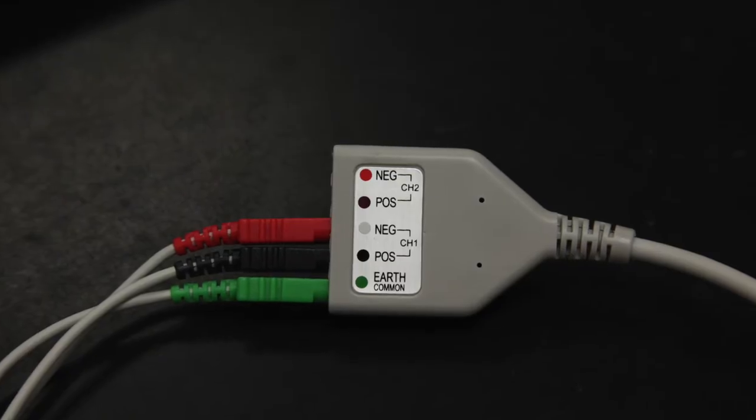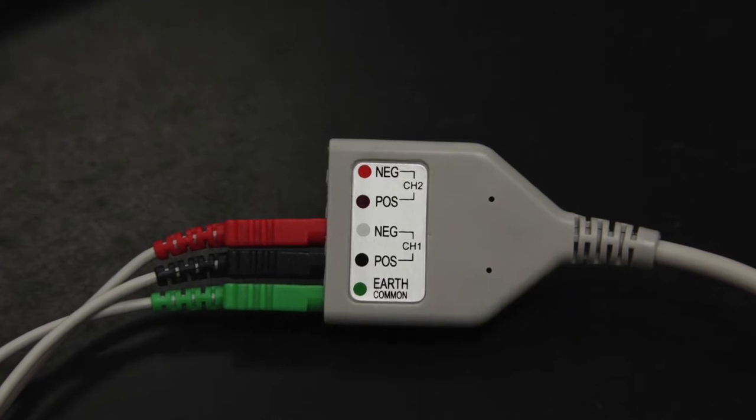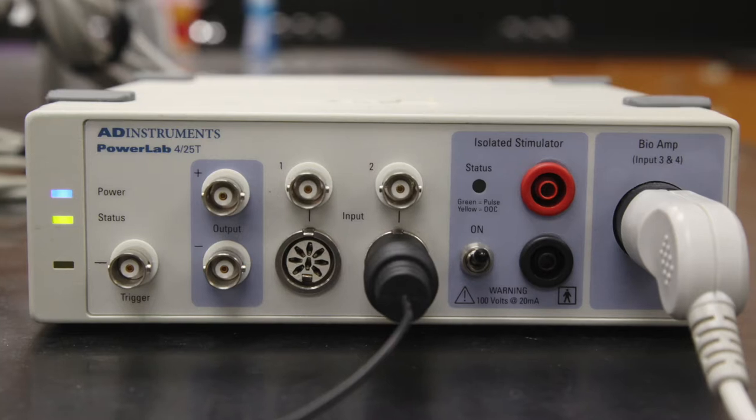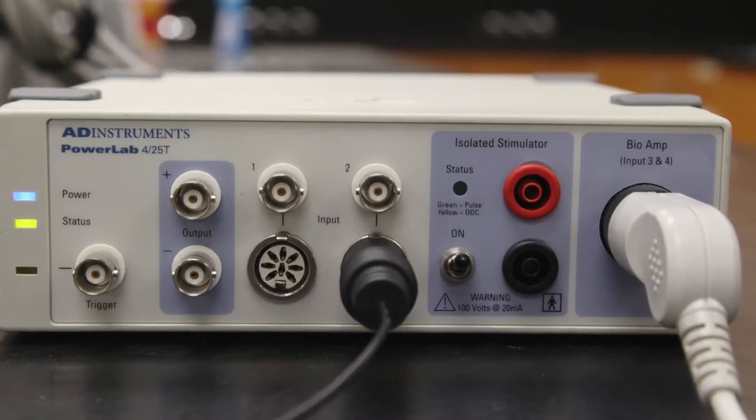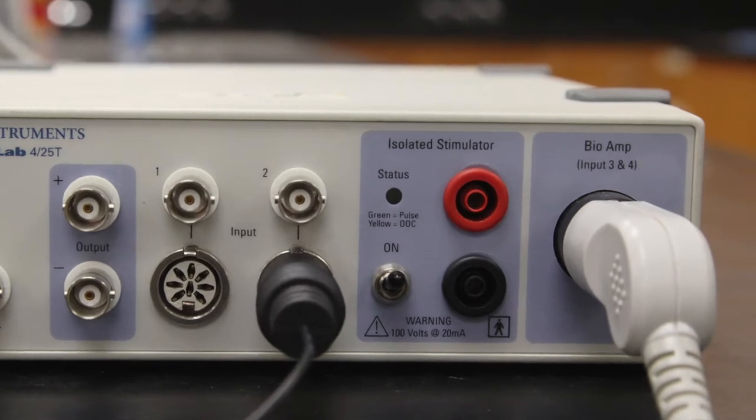First, check the connections. The electrode lead should be plugged into channel 1 as shown. Notice that the red lead is plugged in next to the gray dot. Make sure that the pulse transducer and the bio-amp cable are plugged in as shown. Also make sure the USB cable is plugged into the computer.